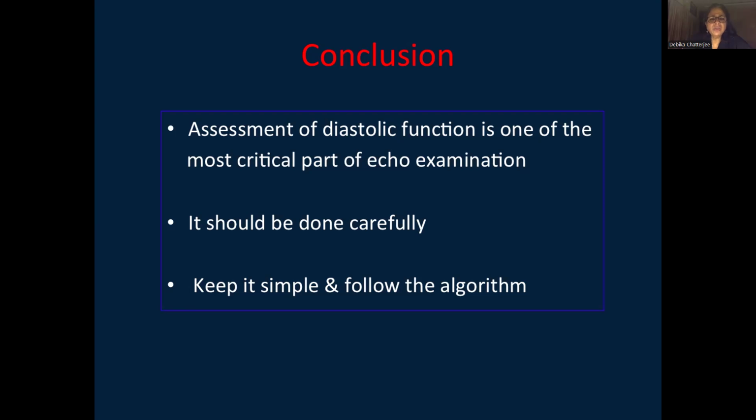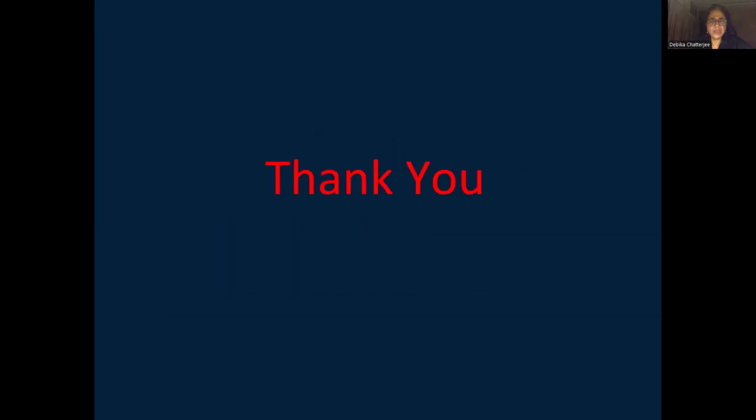So in conclusion, I would say that assessment of diastolic function is one of the most critical parts of the echo examination, as you have understood in this 1 hour discussion. So it should be done carefully, keeping it very simple and following the algorithm and guidelines. Thank you.